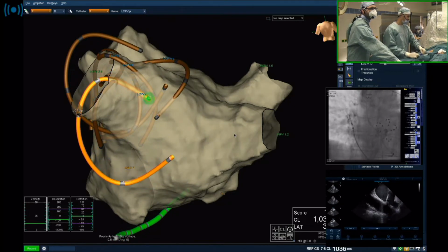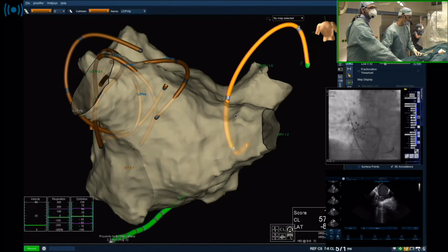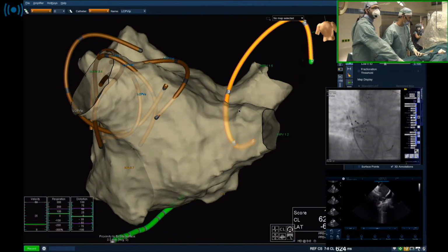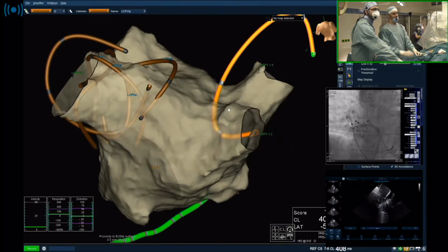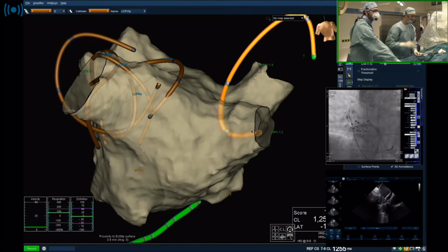So where we are flexed, let's go like this. Now I'm gently advancing the wire. Right inferior. We are right inferior. So Predrag, how do you like it? You see it nice that we are hugging the septal part, we are hugging the posterior part.